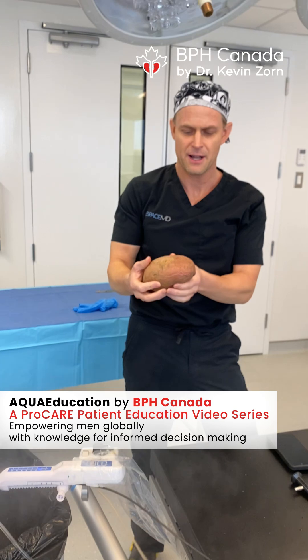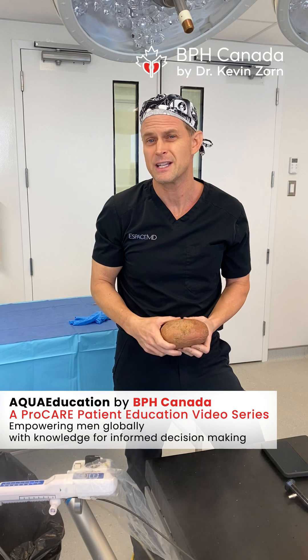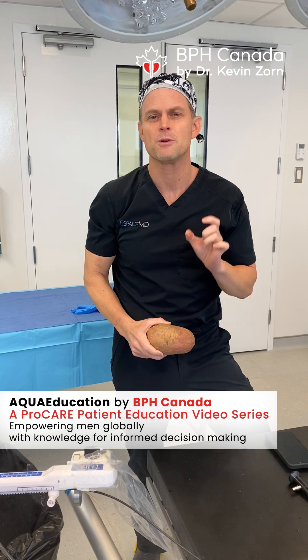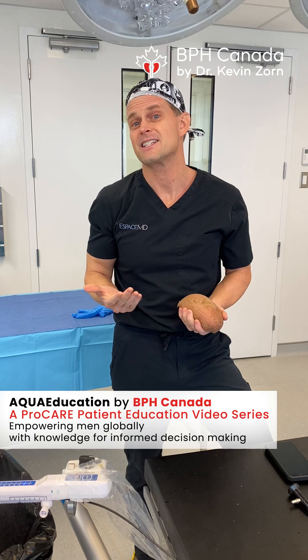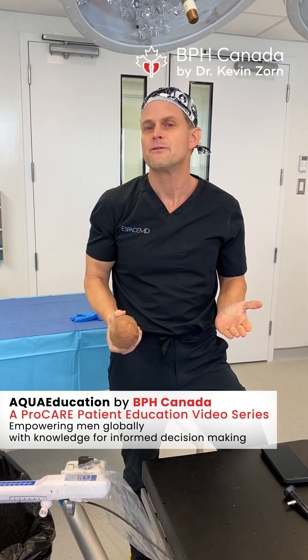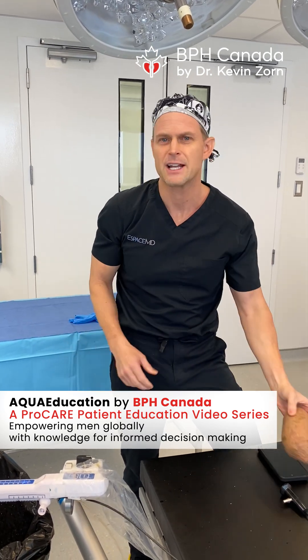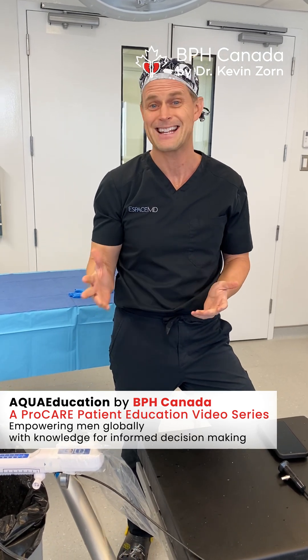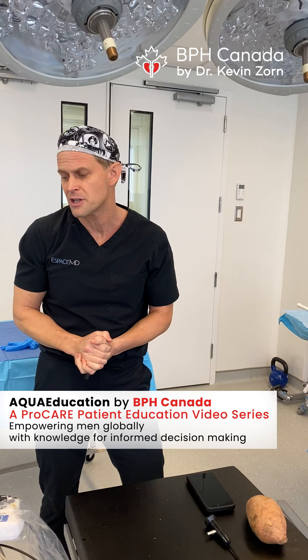All of that is going to be done through the potato — it could be a mock of what a prostate would look like. We're going to see what kind of defect we did in five minutes. And this could be done anywhere in the world, reproducible over and over. Unfortunately, when you do a TURP or other techniques, you don't always get the same outcome — between individual doctors, we're going to get variable outcomes. With this, it democratizes BPH surgery. This new technology has been around and FDA approved since 2018 — it's called Aquablation. If you'd like to learn more, come to bphcanada.com and you can learn about the technology, the technique, and the outcomes.